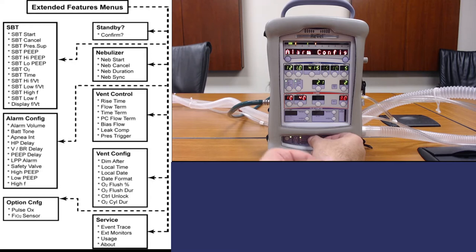The alarm config menu allows you to change the different parameters of the alarms — the volume, the tones, and the delays — but we aren't going to touch those, as they are preset based on the department's mandate. The vent control menu is the other menu we're going to access fairly frequently. This allows you to configure the rise time, flow termination, time termination, bias flow, leak compensation, and pressure trigger. We'll go over some of these items in other videos in relation to specific breath modes and breath types.